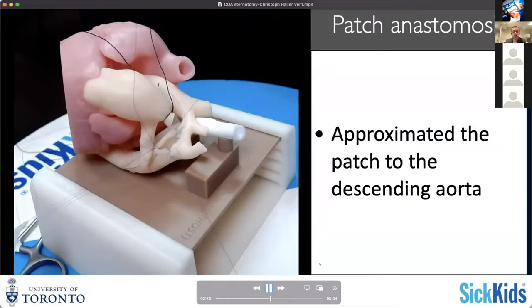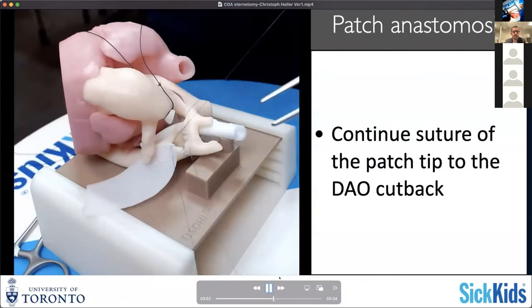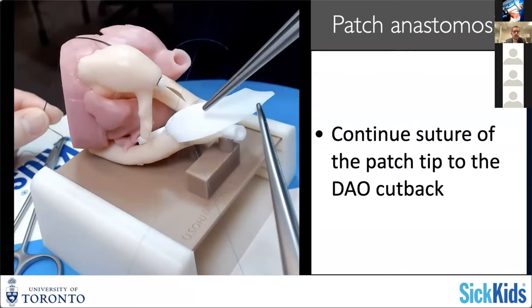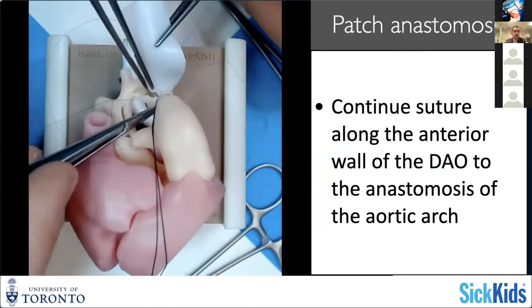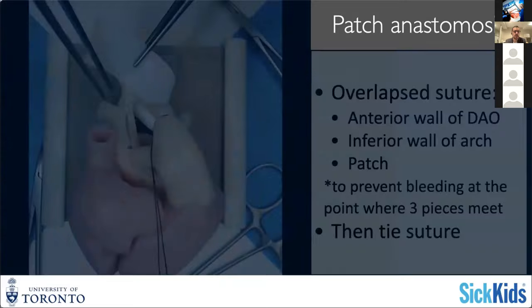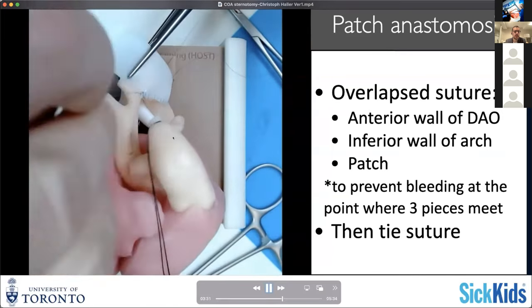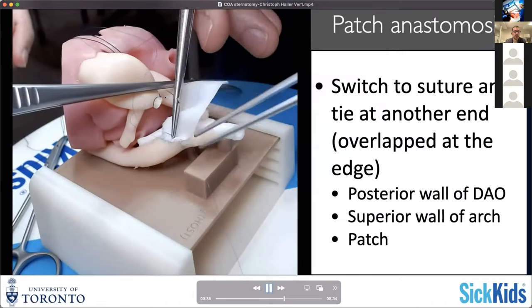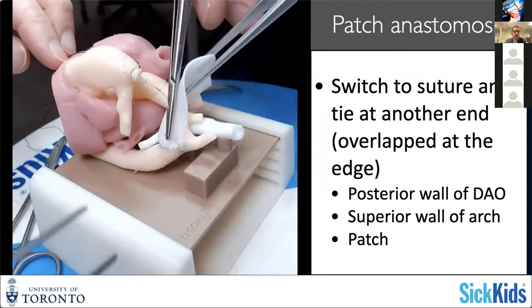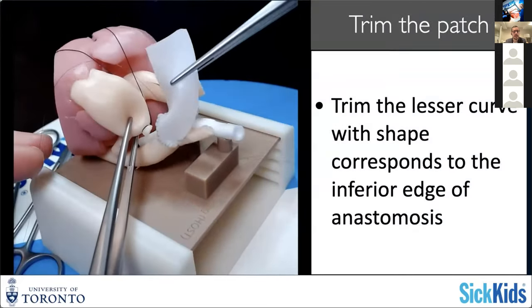You start with a few sutures at the very end of that incision of the descending aorta and then run this up. Towards the descending aorta you can switch to selective cerebral perfusion - usually you're in a timeframe of 15 to 20 minutes there, so that should be a fairly safe time span. Then you're running that suture up until it meets your previously placed stitch. I usually triple that stitch, so you may have seen that I use the descending aorta, aortic arch, and the patch with one bite to make sure that this is fairly sealed. That's a typical place for a little bleeder.